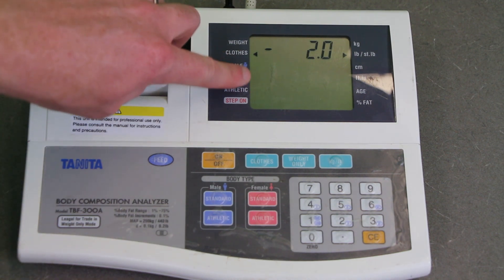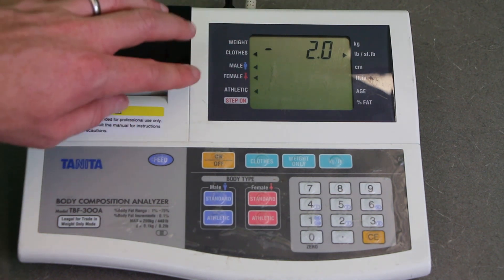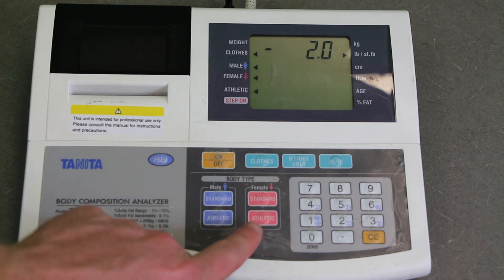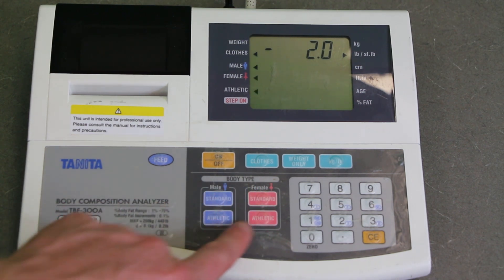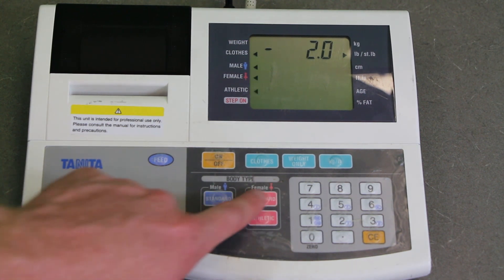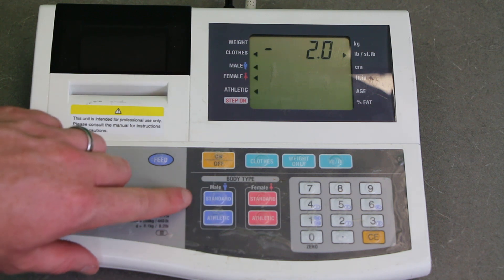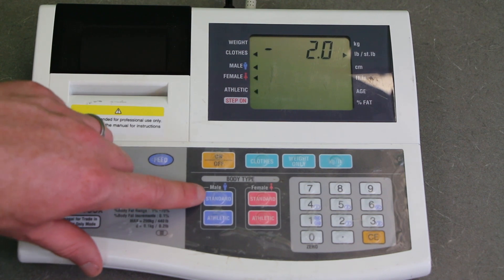Now the blinking arrows are in the section for male or female and athletic versus standard. There are four buttons: the top two are standard, the bottom two are athletic, with two for female and two for male. Athletic for this machine means the individual does at least 10 hours of exercise per week and often has a resting heart rate under 60 beats per minute due to their athletics. For this individual and most people, you're going to hit standard male.